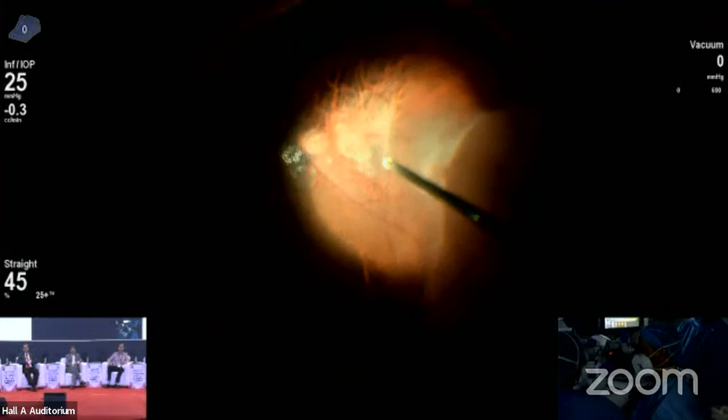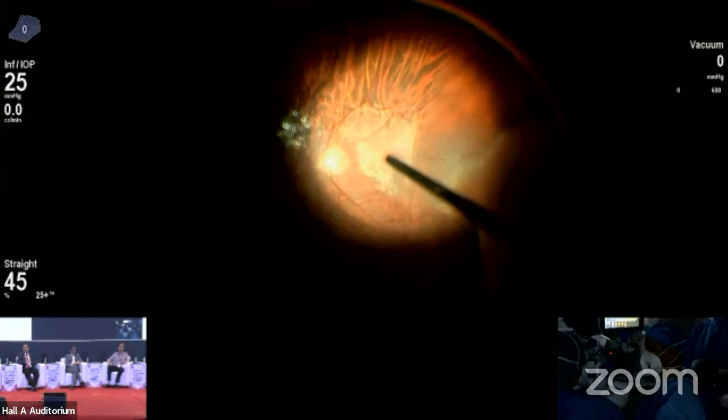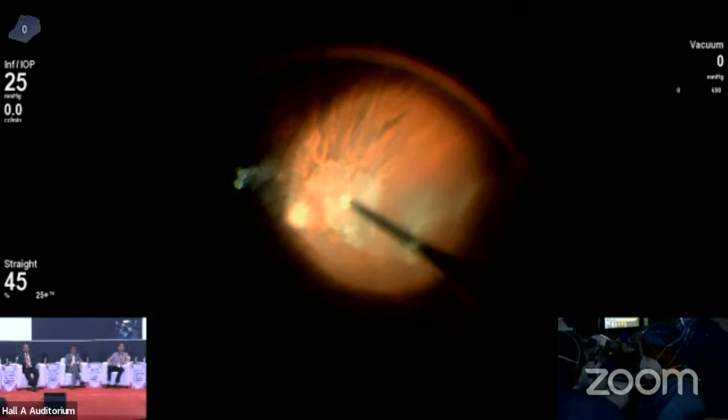Yes. So if you can see, a large majority of the crystals flew off, but some of them are sticking to the posterior pole. So in this scenario, I'm suspecting there is a vitreoschisis. So we'll go to the high magnification with the help of a contact lens.